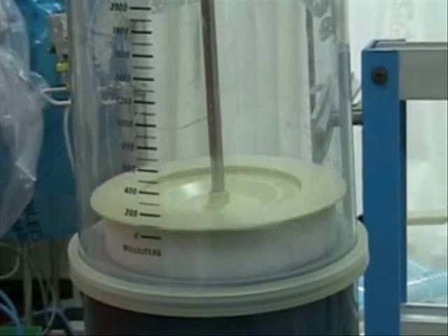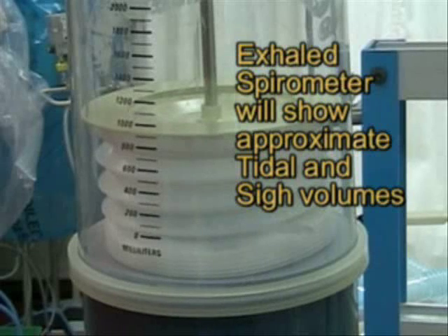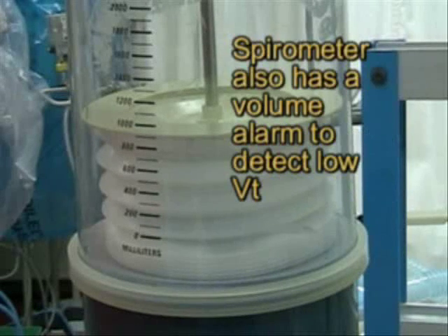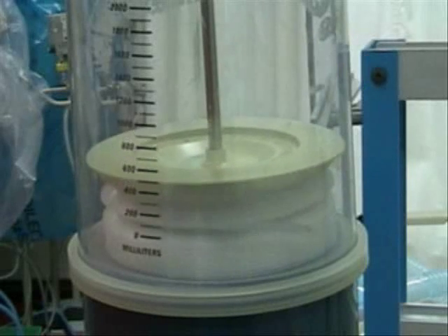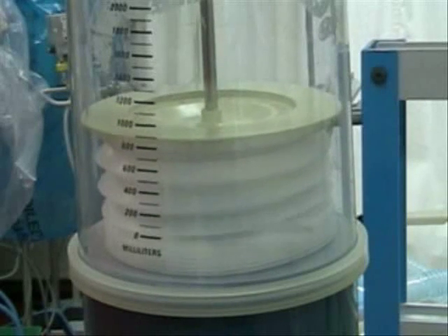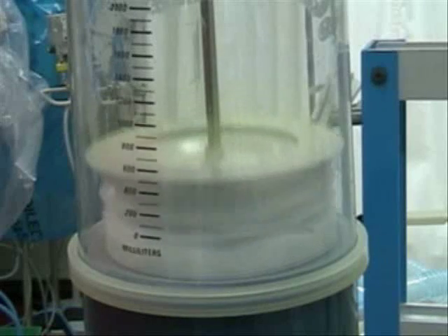You can get an estimated idea of our tidal volume by looking at the exhaled spirometer. You can see we're delivering about 900 mL, and the exhalation into the spirometer is receiving about 900 on the normal tidal volume.